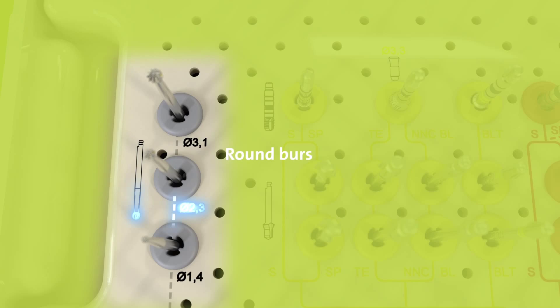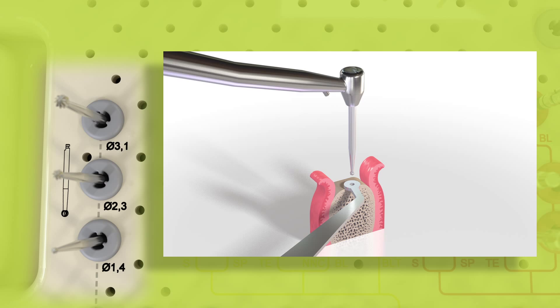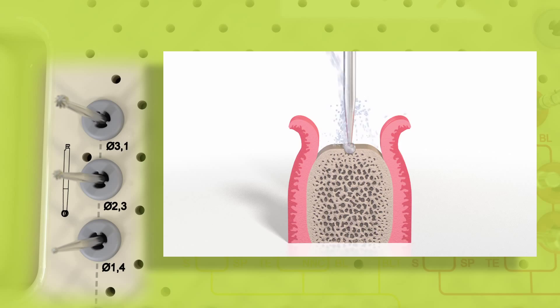At the bottom left, three round burrs are stored. They are used for flattening the alveolar crest, for marking the implant bed position, and for enlarging the entrance hole.